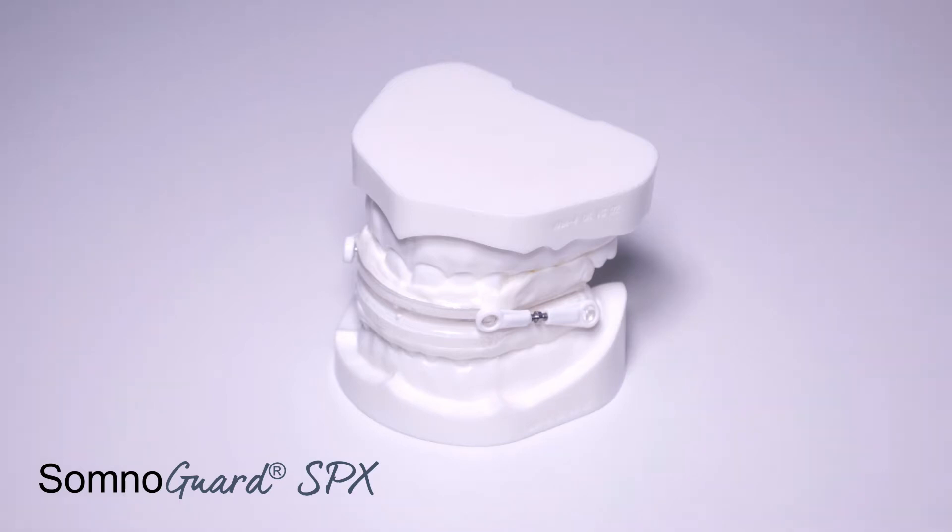In this video we'll explain how to fit the Tomed Somnoguard SPX oral appliance.